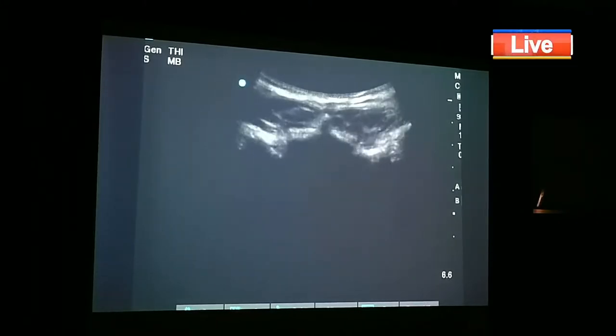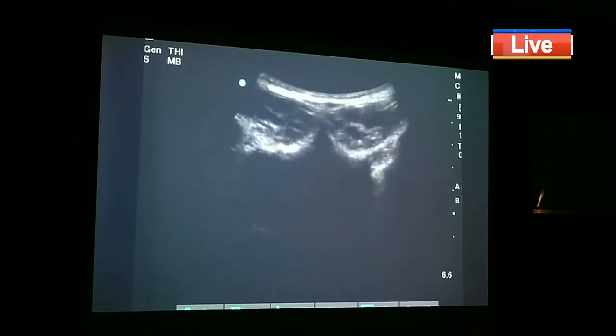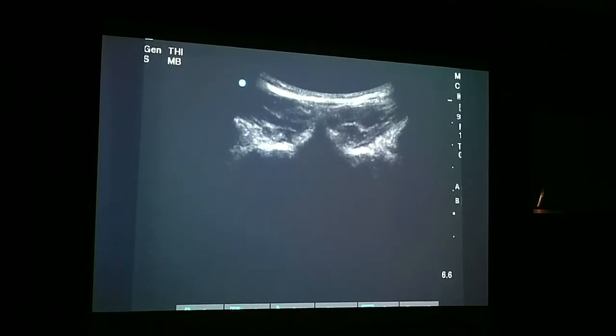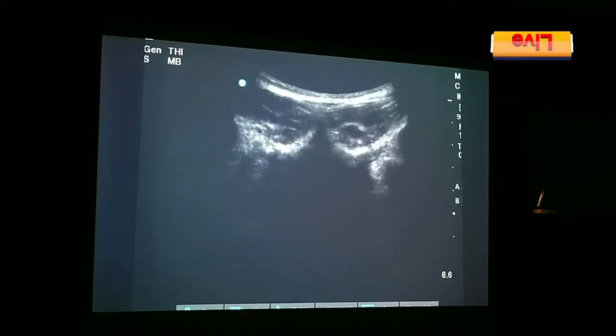So this is one foramen, probably this is S2. Further I go up, up, up. Why S2? Because there is still one above it. The last one that comes will be the S1. Then come down again from above. Sometimes you can give an S2 block also here, directly. Okay. Now we go further up.